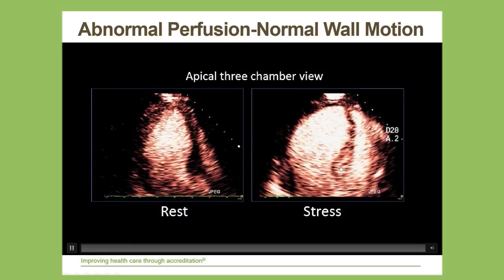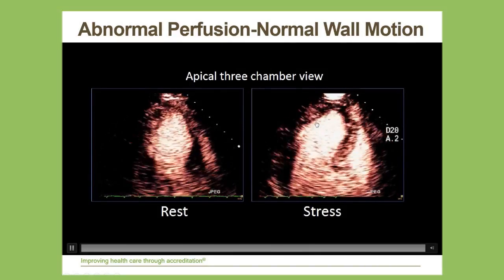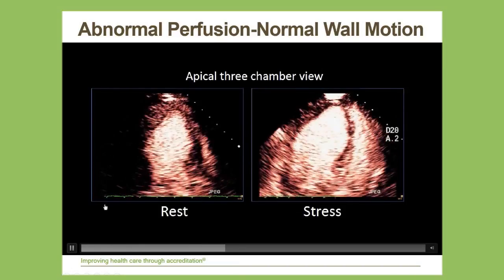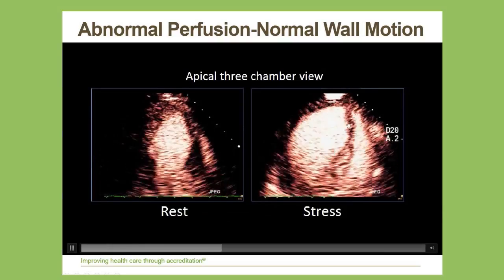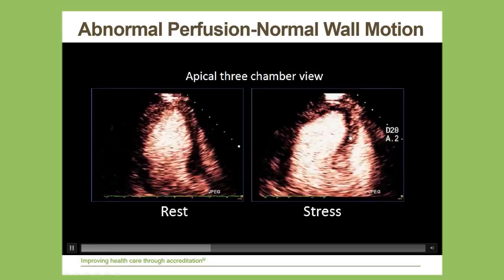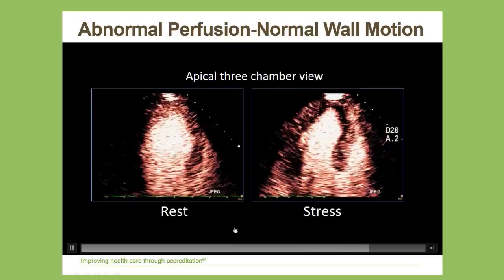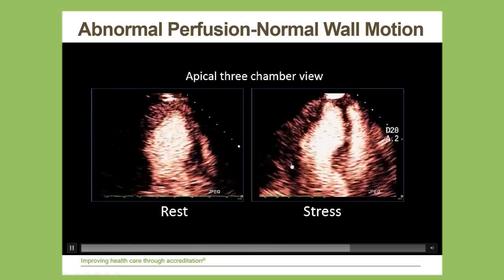Here's a patient during dobutamine stress echo that has a perfusion defect that you can see all along the anteroseptal and apical territory here, as well as the infralateral segments, while wall thickening appears primarily abnormal just in the distal anteroseptal and apical segments. The patient had multivessel coronary artery disease, which was much better detected because of the extent of the perfusion abnormality, whereas wall thickening really appeared only confined to be abnormal in the LAD territory. Contrast has been better at identifying the extent of the perfusion abnormality and the extent of the coronary disease than wall motion analysis.